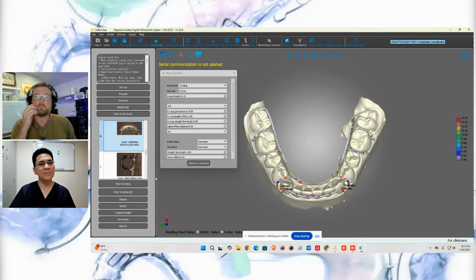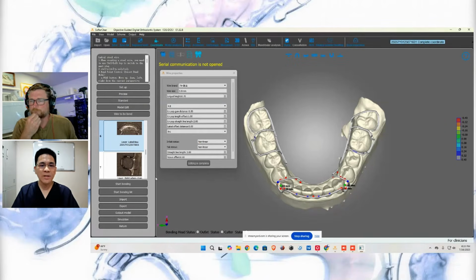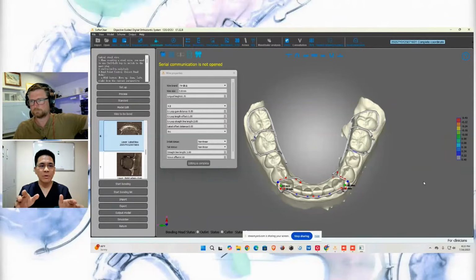So you did mention you're setting up an online digital designer for small labs, where you'll design the wires and then it gets sent to here? Yes, I mean the ODC, Online Design Center. Oh, okay. Because I think usually for a small lab, maybe they have one person to focus on the digital design for 3D wire.